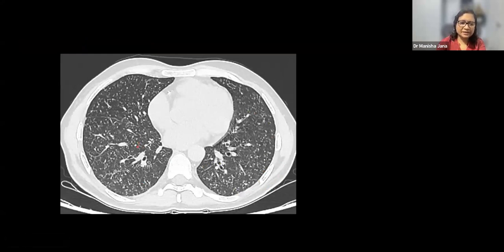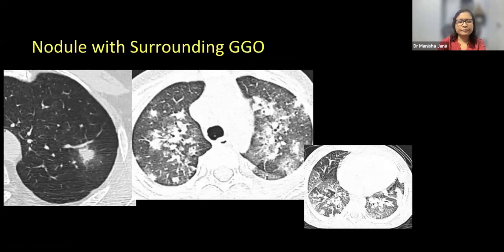See, the nodules are very clearly defined. You can see the margins, they're very sharp, very well defined, very tiny nodules, millet shaped. So this is quite suggestive of miliary infection like tuberculosis in our scenario.